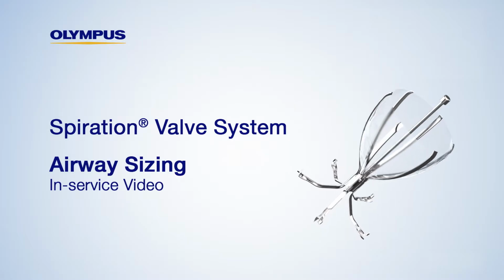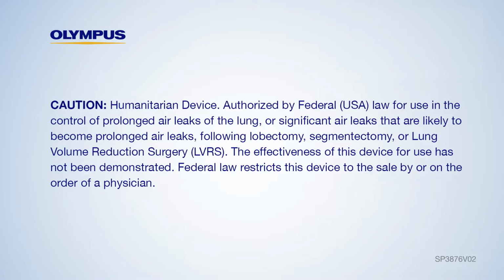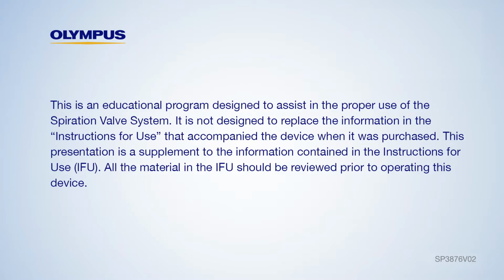Welcome to the Spiration Valve System Airway Sizing in-service. Today, we will review the proper steps for sizing the bronchial airway for determining the correct size Spiration valve to use.